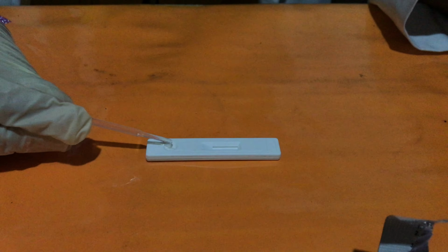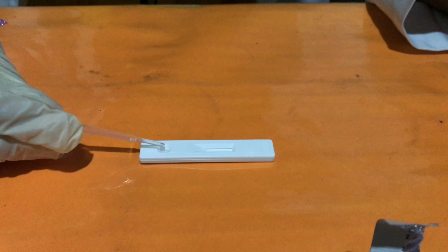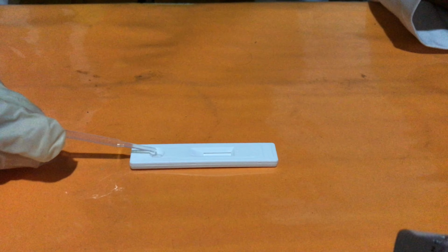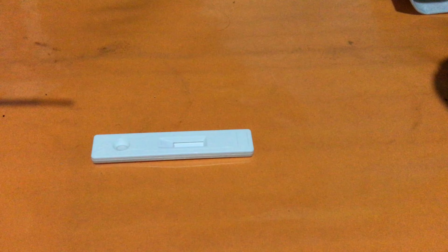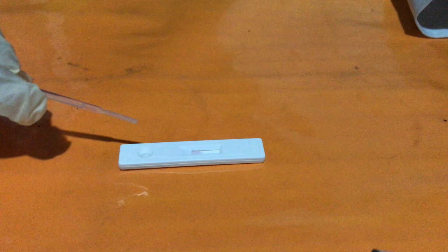At least 2 to 3 drops. 1, okay, 2, okay, 3. Okay, so right after that we will have to wait at least 5 to 10 minutes for the results on the indicator area. Okay, so we'll just wait.